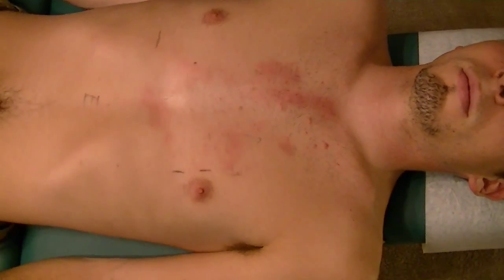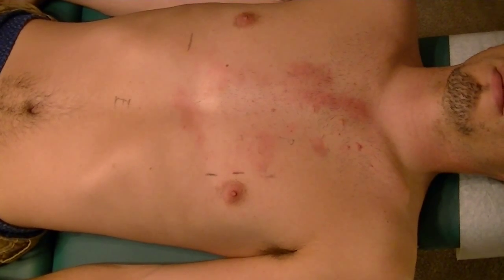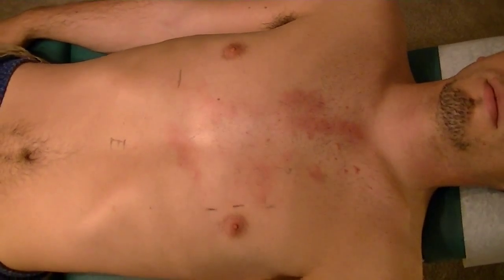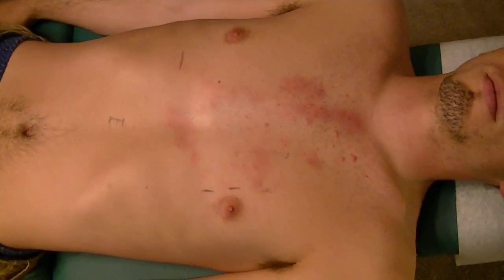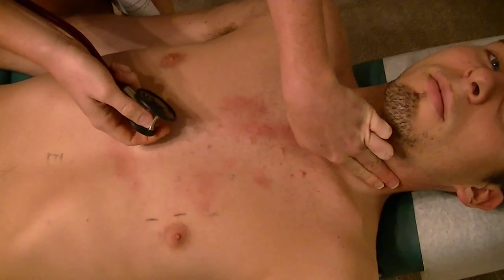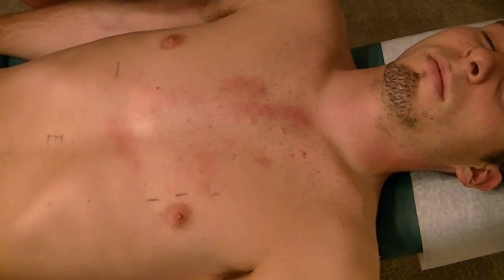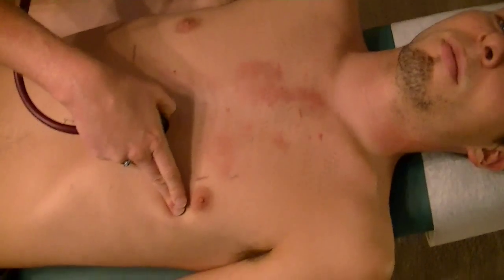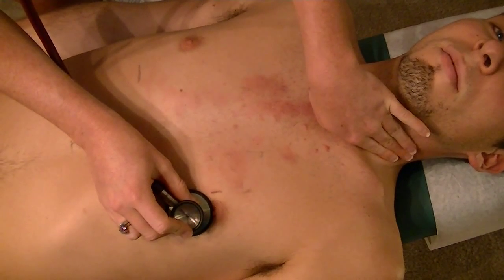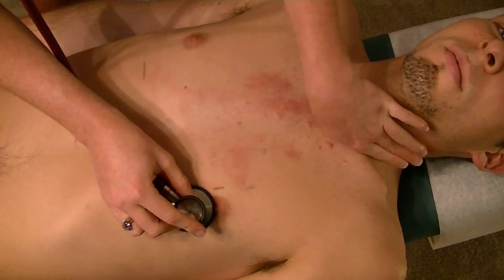So we're going on to auscultation of the heart. I'm going to start over at the mitral area. I'm using the diaphragm to auscultate for S1 while palpating the carotid pulse. Alright, diaphragm. So you're going to go ahead and feel for the carotid pulse right here. And we're going to check in the mitral area, so we already know where that's at, right beneath here in the 5th intercostal space. Placing the diaphragm right there and feeling for carotid pulse. And then what you're checking here is to make sure that you can hear and you're feeling the pulse at the same exact time.